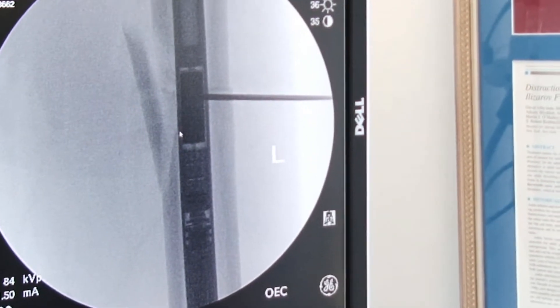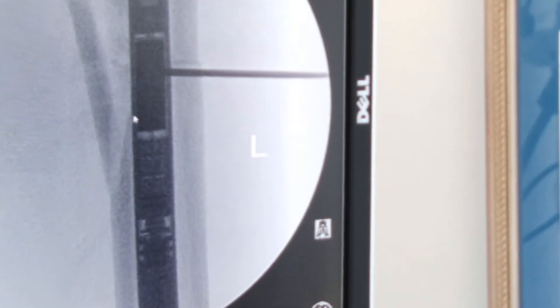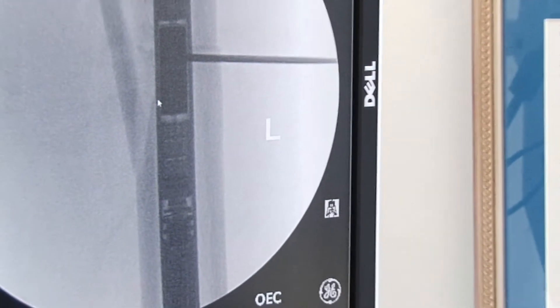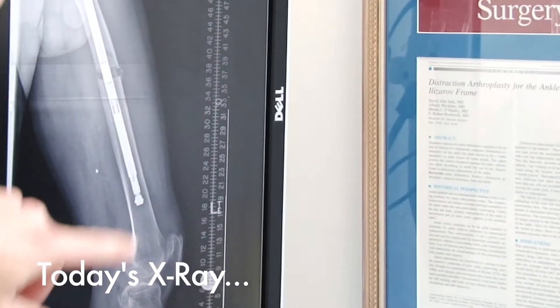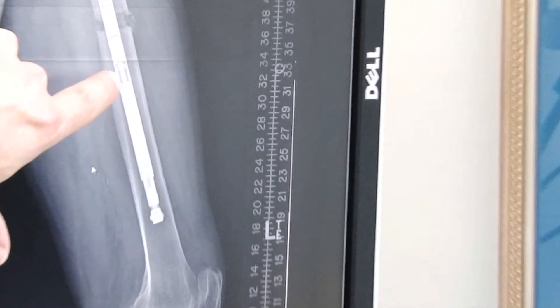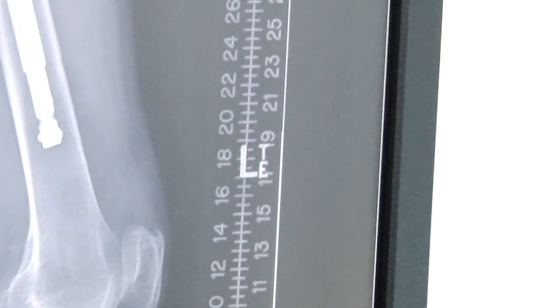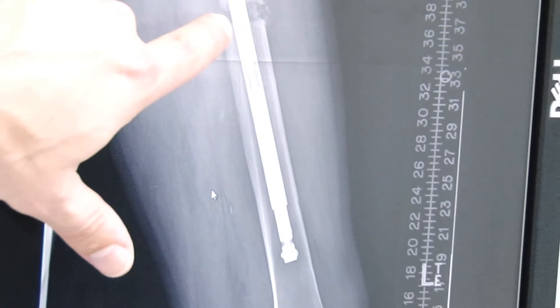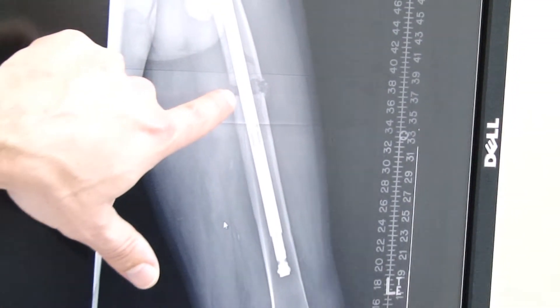So the dot that we put on your skin to mark the magnet is exactly corresponding to that location. That's what I do — mark it so that we know exactly where to put that external magnet controller that you've been using for the last two weeks. So this is the femur, and what you're seeing here is the rod in place. This is the magnet. And you see this little gap here, measuring 14 millimeters exactly? That's the 14 days of distraction that you've been doing. The telescopic part has elongated, and you can see the gap that is starting to develop in the bone.